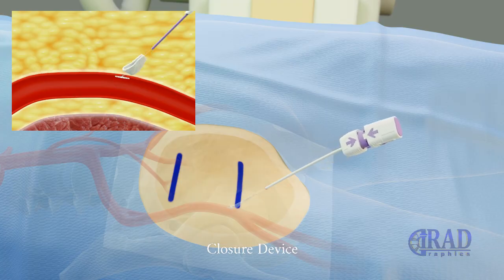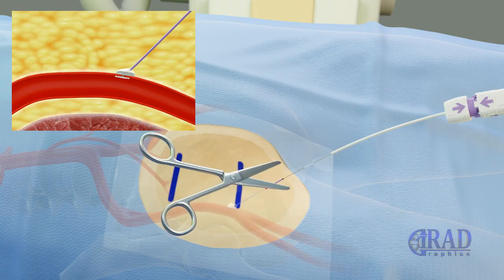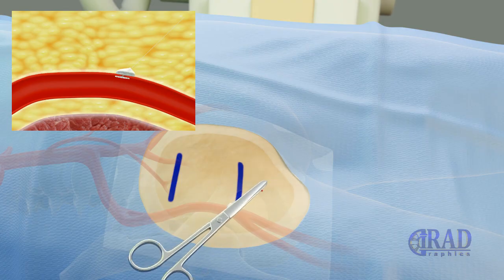until resistance is felt. After feeling resistance, the middle plastic piece is pushed back over the string into the tract till the collagen is packed on the outside of the common femoral artery. Then, the string is cut by scissors in the middle part. And after removing the middle plastic piece, the rest of the string is trimmed at the level of skin.